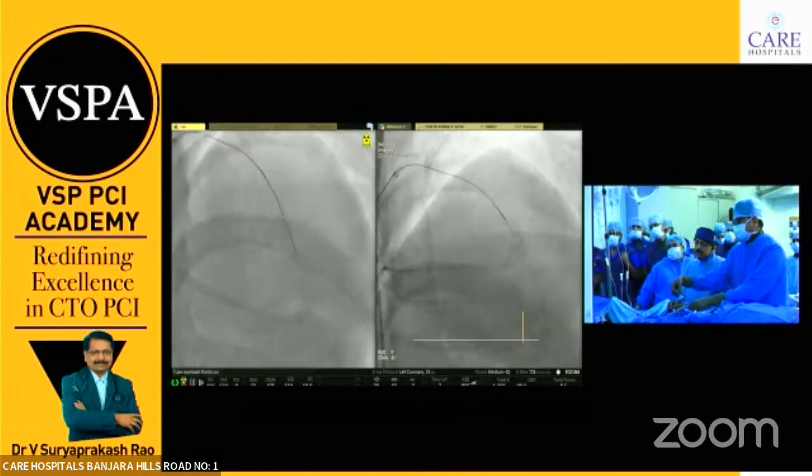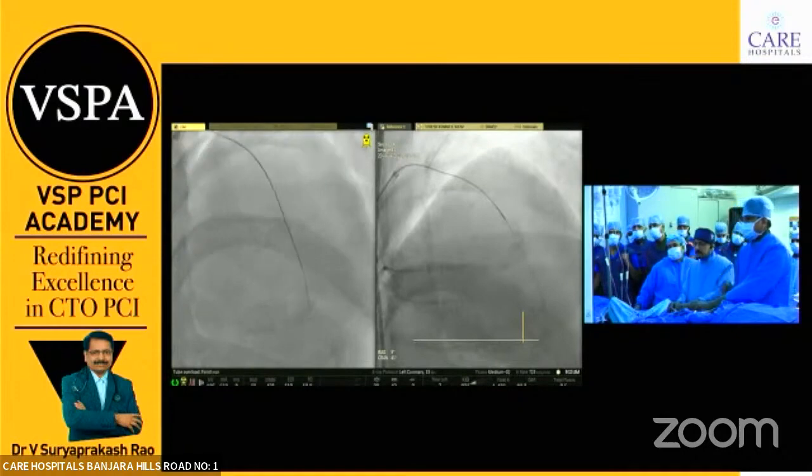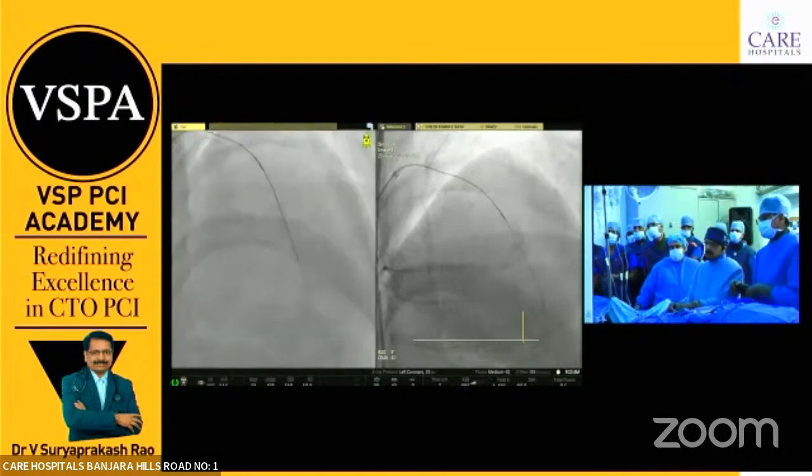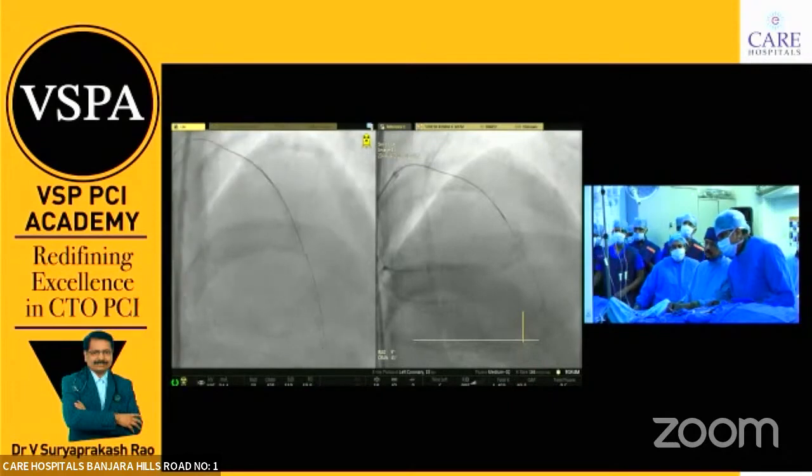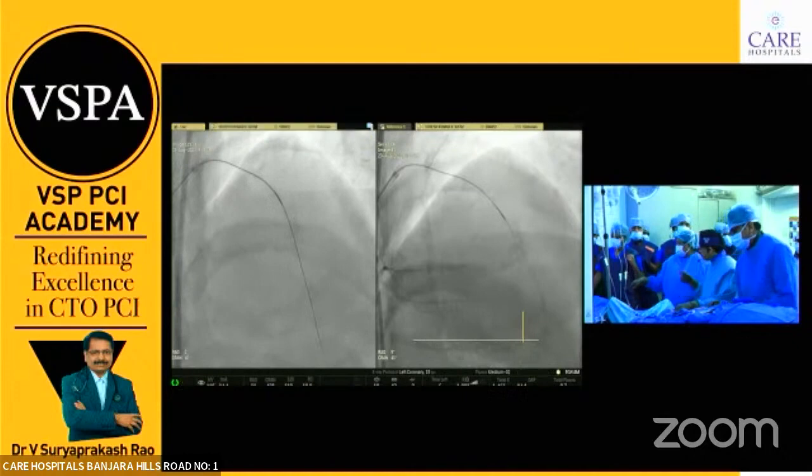You see, that's why I crossed it when he is doing the cine, I crossed it. Now I am confident. I entered. You can show the cine again.